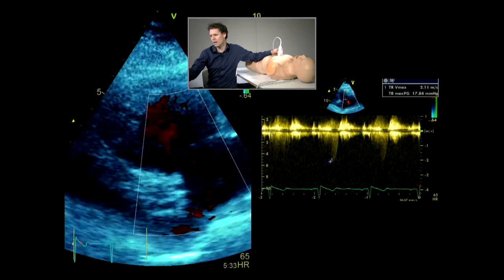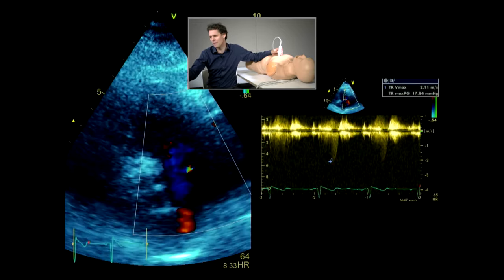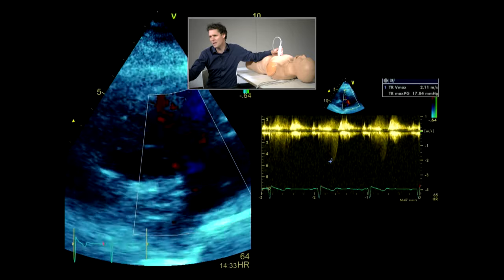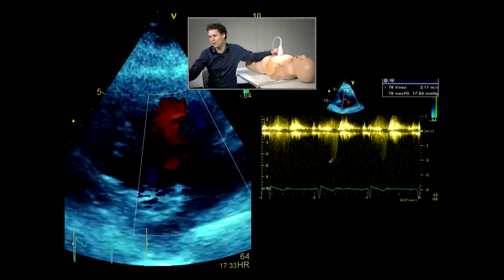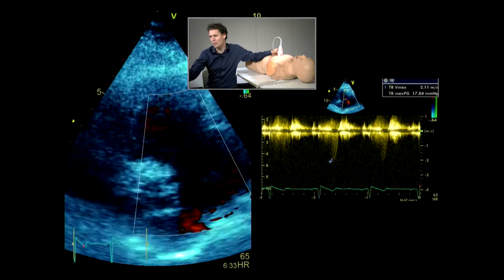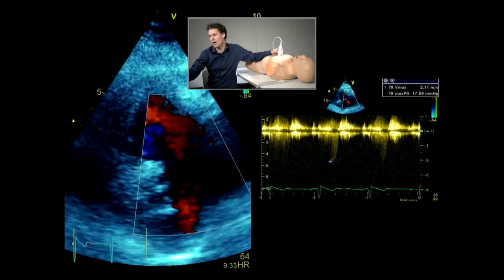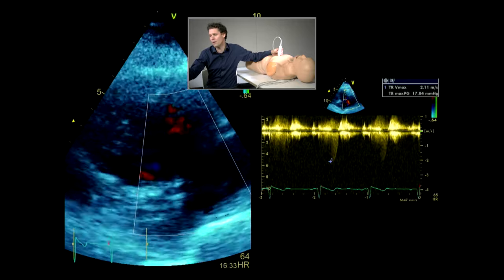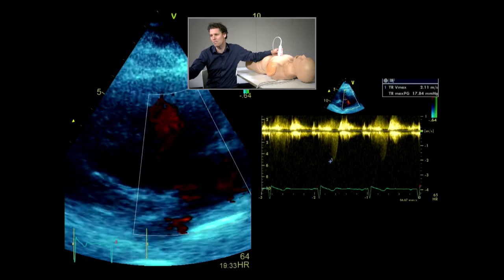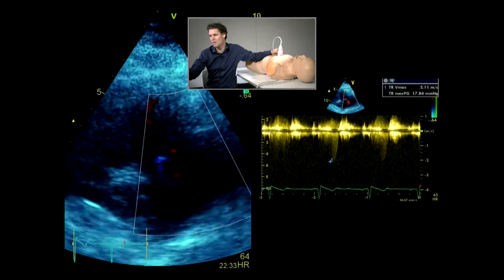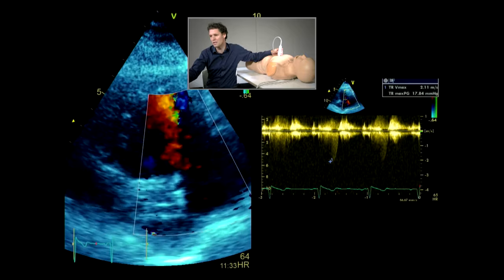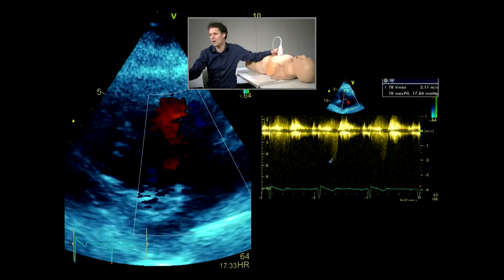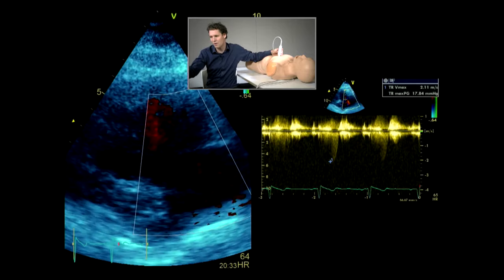Now I'll show you what a normal trace is meant to look like here. This is just a trace of tricuspid regurgitation. One of the things I want you to start to have an idea of is when we're using a color Doppler, we use it to direct our cursor so that we can put it through the continuous wave cursor through the area where we suspect there to be the most tricuspid regurgitation. We're using the color Doppler box to guide our continuous wave Doppler interrogation profile.